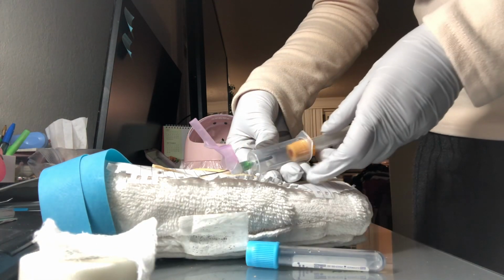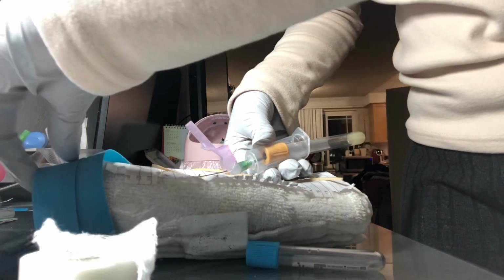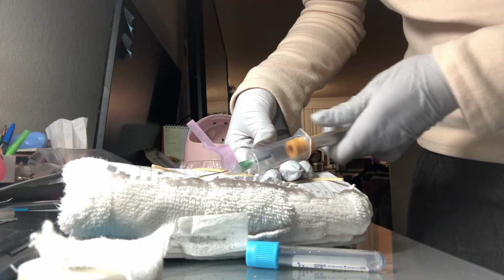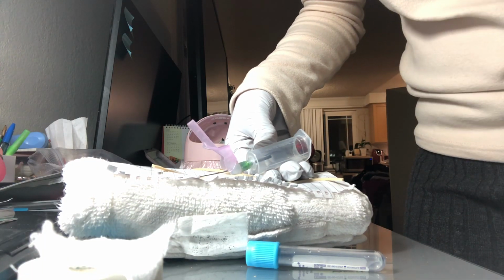I'm going to use the third tube here, and during the middle of the third tube, I'll remove the tourniquet, and also remove the third tube with inversion.